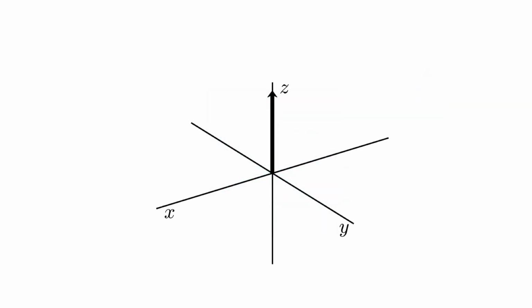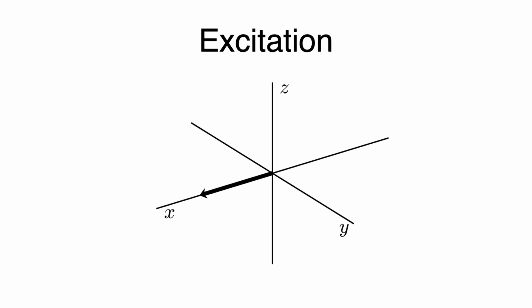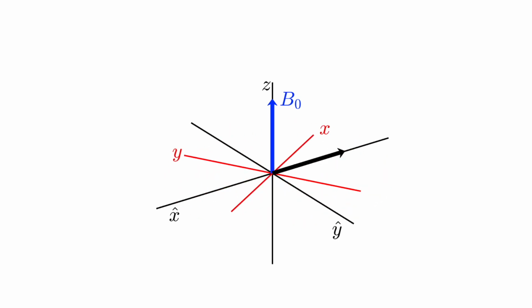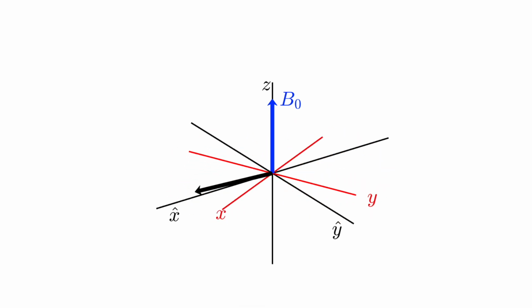That rotation is what we're going to use to see the particle, but how do we even get this net magnetic vector into the xy plane? The answer is through a process called excitation. So we turn on a magnetic vector, B1. The hydrogen's magnetic vector precesses like it does before, and then we turn it off when the vector precesses into the xy plane. That's excitation. Note, it's stationary only in the rotating frame. In the lab frame, it's precessing like before at 64 million revolutions per second.